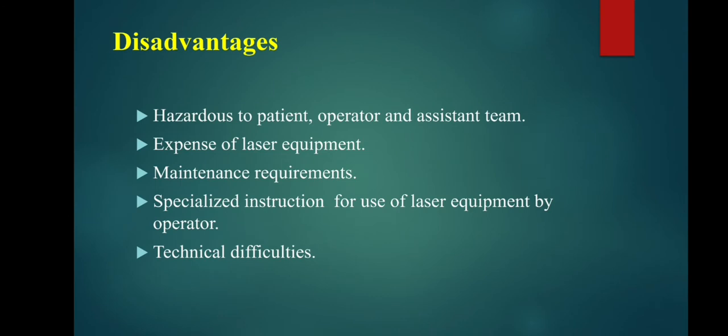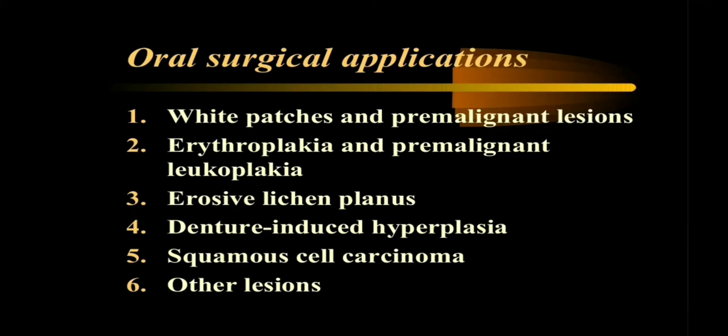Disadvantages. Hazardous to the patient, operator and assistant team. Expense of laser equipment. Maintenance requirements. Specialized instructions for the use of laser equipment by operator and assistant team. Technical difficulties. Oral surgical applications.